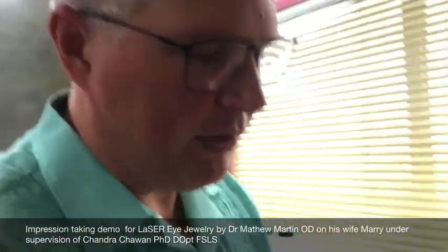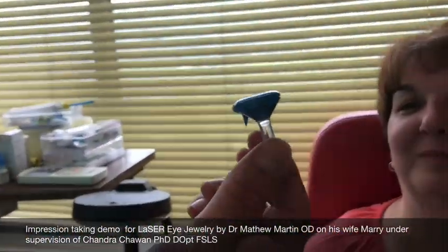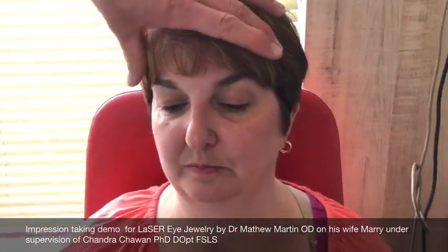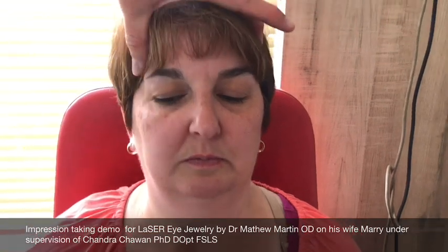We're waiting about 40 seconds approximately, so there's a little bit of art to this for sure. In a moment we're going to start out by having the patient look down, and we'll give them a fixation to look at. So we're going to go down to the side — I'm going to turn your head slightly to the side because that's the way my right hand reaches.